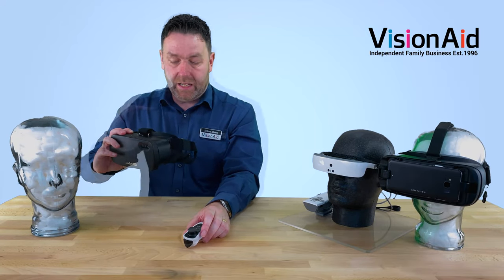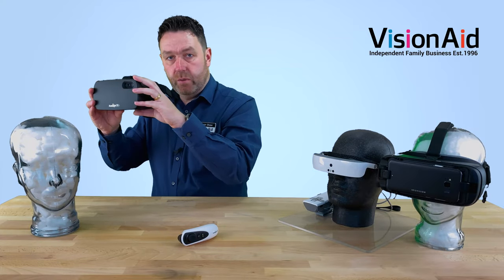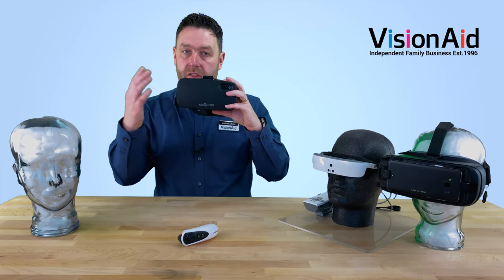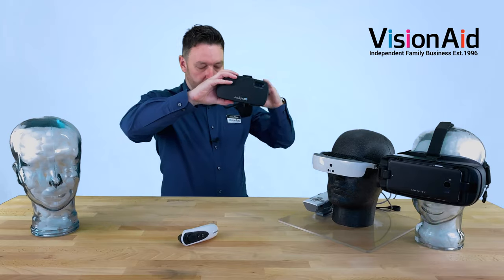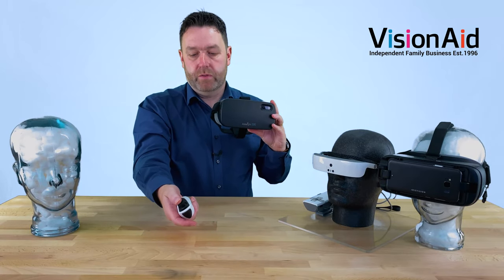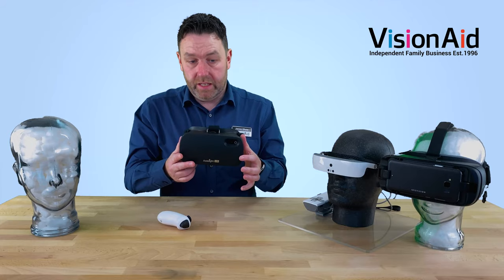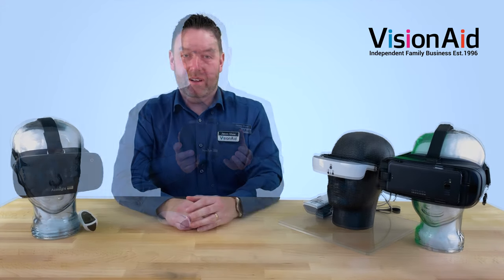It runs at 60 frames per second, which means a fast refresh rate. So when you're watching live action — maybe at a football match where things are moving quickly — you'll get a much smoother image. It magnifies up to 16 times, going all the way from 1x up to 16x, simply by pushing forward and backwards on the joystick. Battery life is around about three hours on its lithium-ion battery.